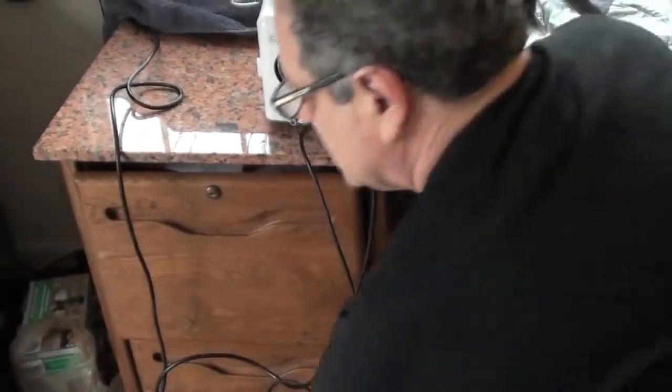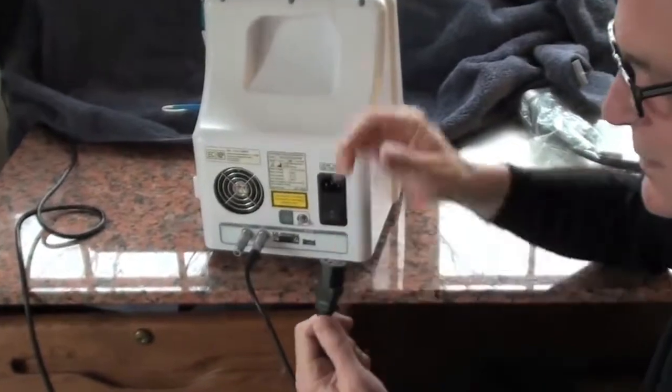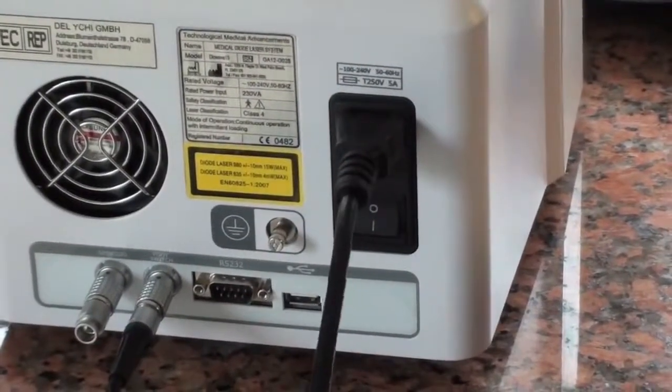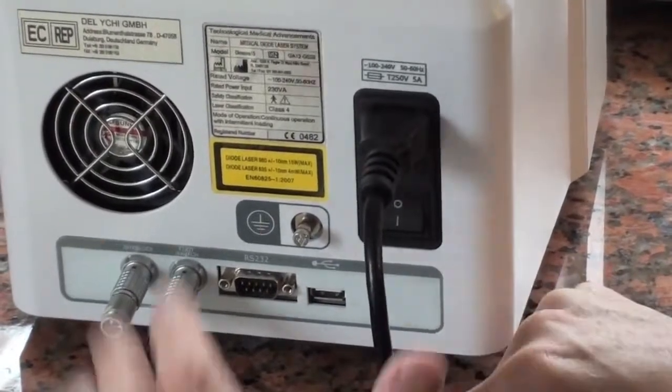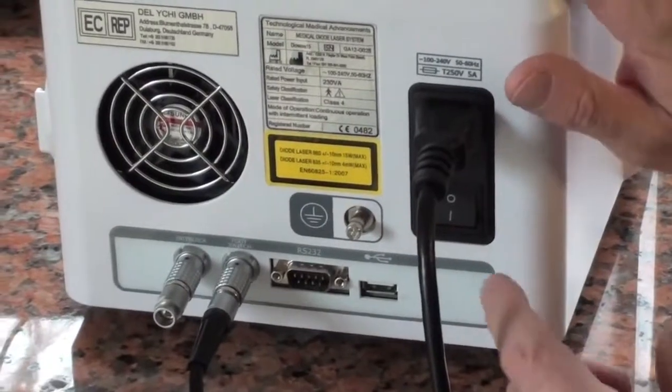The last thing that needs to be plugged in - remember everything is turned off - is the power cord. Slips in, make sure it's tight. This is a typical classical power cord that you use in a computer. So everything is set up: the interlock, the foot pedal, and the power cord.